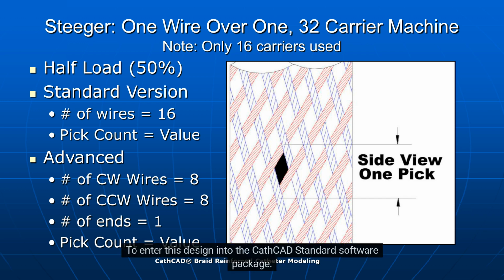To enter this design into the CathCAD Standard software package, the number of braid wires is set to 16. The pick count entered should be that of the desired value. To enter this design into the CathCAD Advanced software package, the number of clockwise wires is set to 8. The number of counterclockwise wires is set to 8.